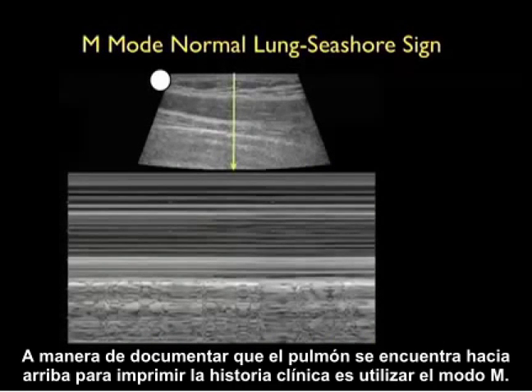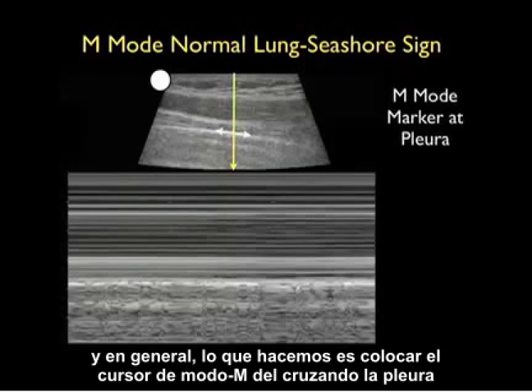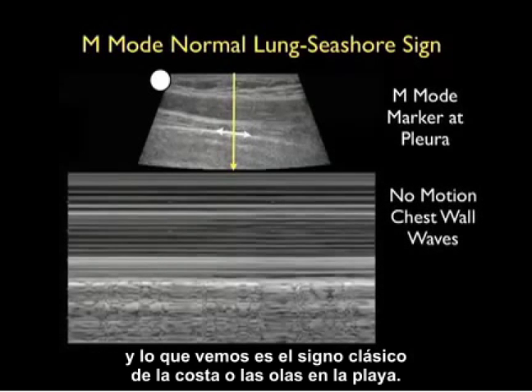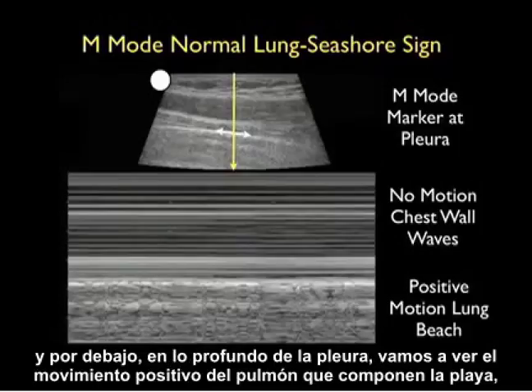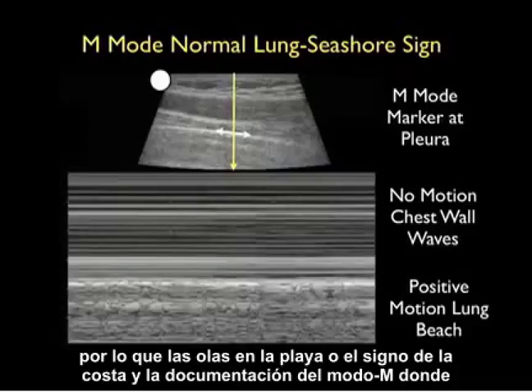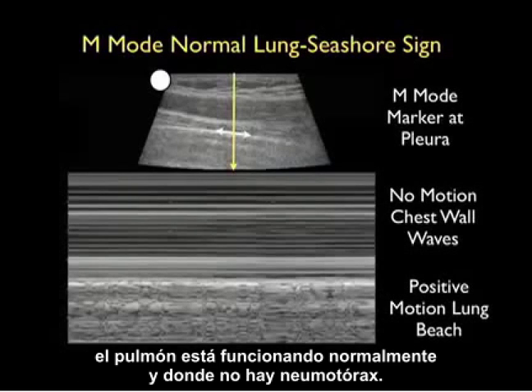A way to document that the lung is up for the chart is to use M-mode, generally locating the cursor right at the pleura. What we see is the classic seashore sign, or waves on the beach. Anteriorly we see the classic waves — no motion of the chest wall — and below that, deep to the pleura, we'll see the positive motion of the lung making up the beach. The seashore sign in M-mode documents that the lung is up and that there's no pneumothorax.